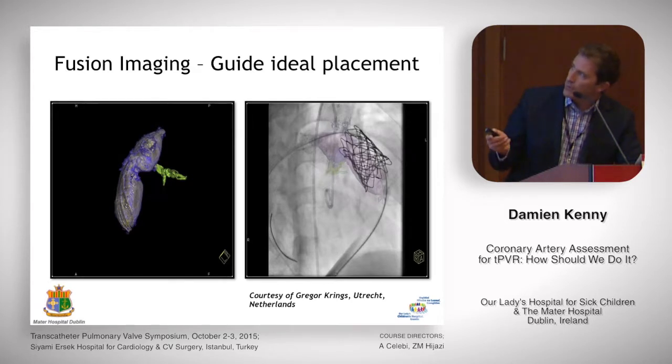But the Melody valve goes up, and they get a very nice result at the end of it that shows that, again, this is ensuring that the pre-stent is dilated to an adequate size, and that most of that waisting is out of the way.